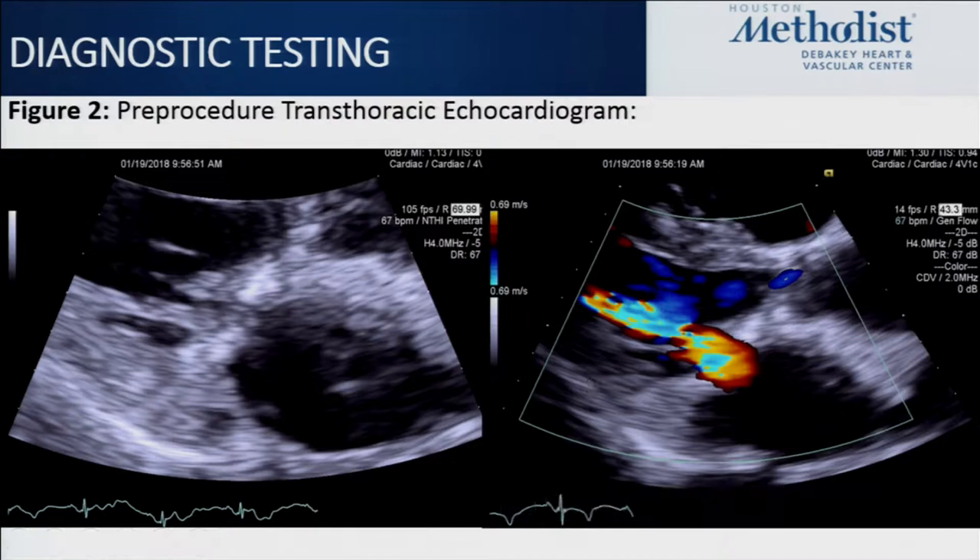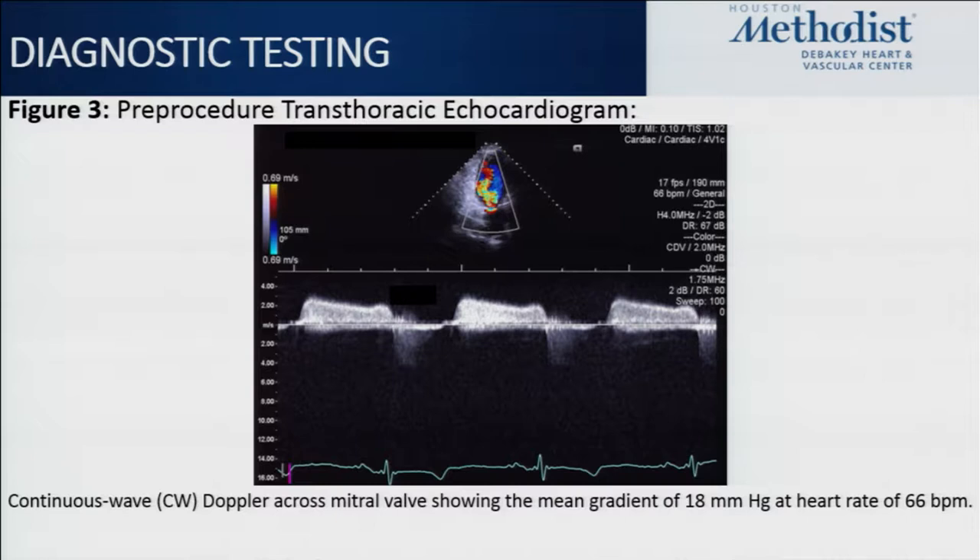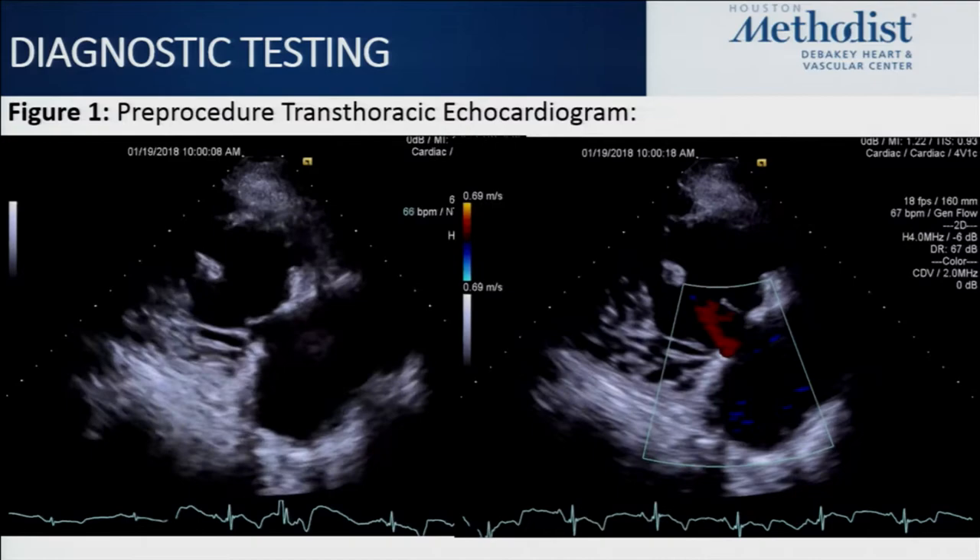Also noted was severe annular enlargement with very poor coaptation of the tricuspid leaflets and moderate to severe TR. So the question is: what to do next?